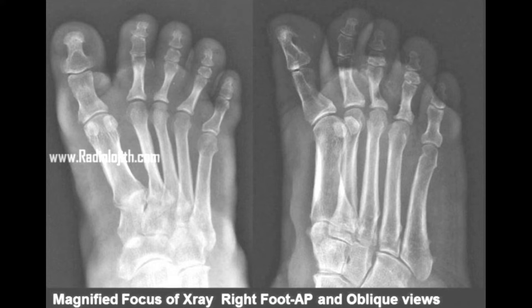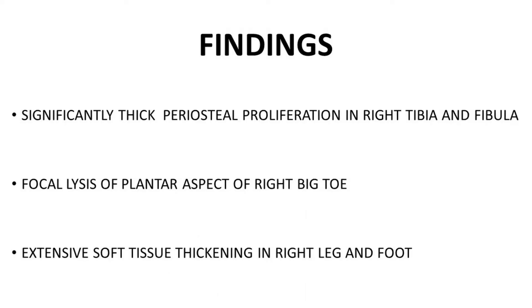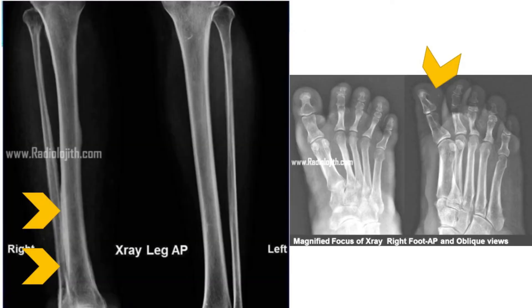The X-ray of the right leg — and I think X-rays of both legs are given. There is periosteal proliferation observed in the right tibia and fibula. Comparing with the left side, you can see the periosteal proliferation is very thick and is observed in the right tibia and fibula, but not in the left tibia and fibula. The periosteal reaction of the tibia and fibula is well recognized.